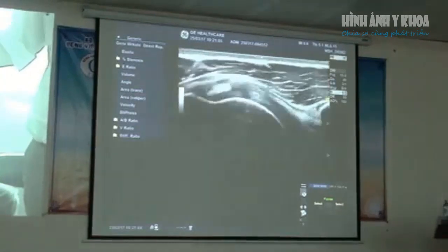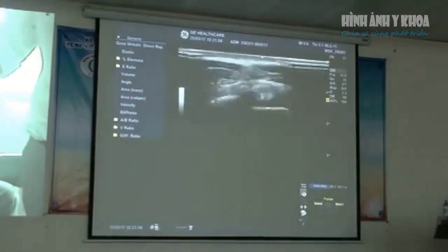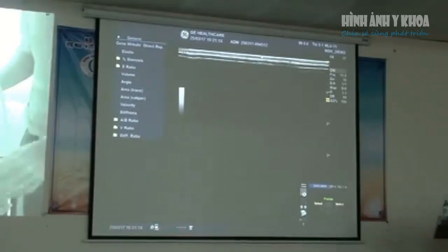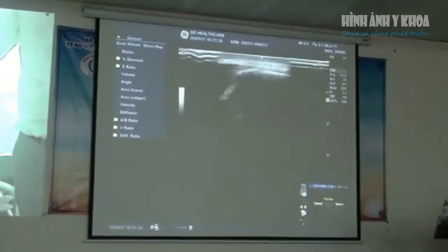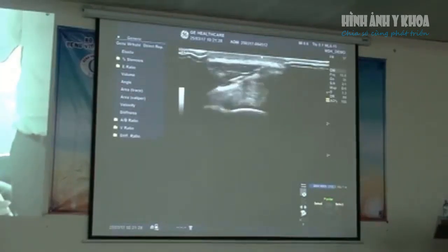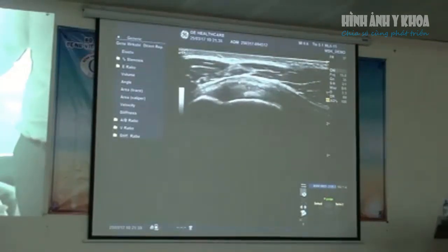So next I'll have a look for impingement of the supraspinatus tendon and bursa. Now we'll examine for subacromial impingement, bursitis, or supraspinatus tendon pathology. So once again, I start off with the patient's hand in a neutral position, palm up, with no internal or external rotation. In the longitudinal plane, find the acromion and then just slide slightly anterior.